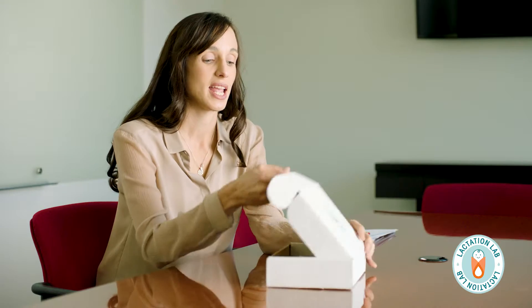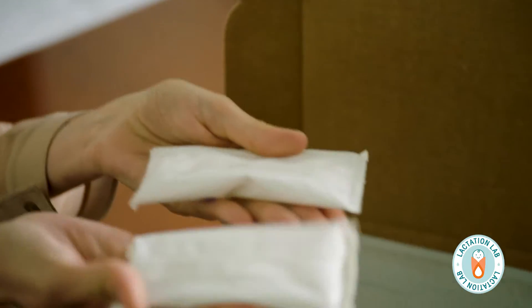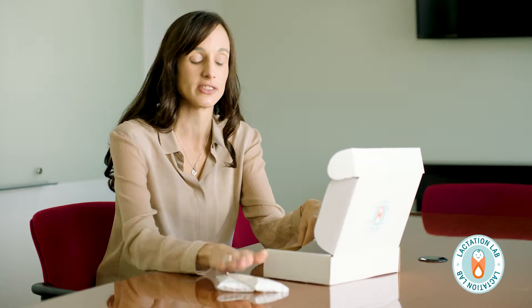So when you order or purchase one of our test kits, you'll get this box at home. When you open it up, the first thing we recommend is that you take the gel packs and place them flat in your freezer and freeze them.